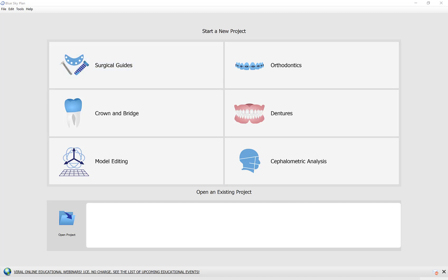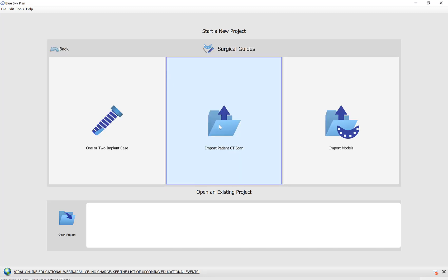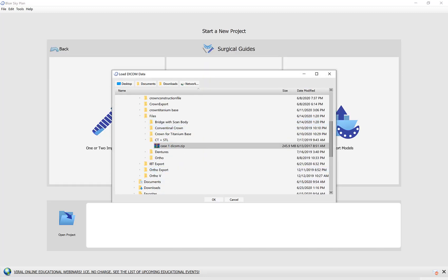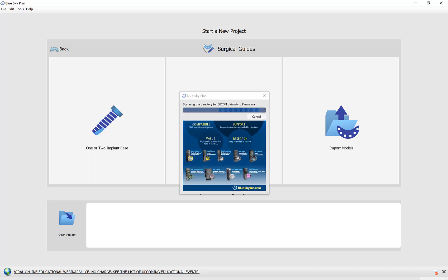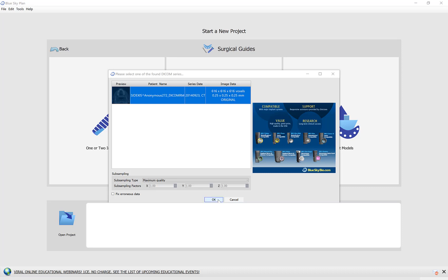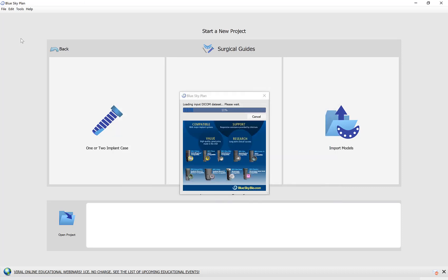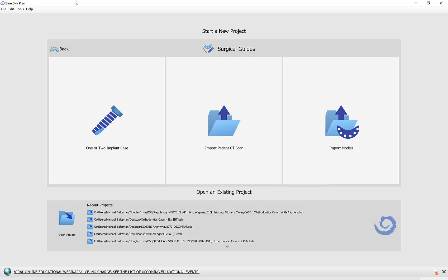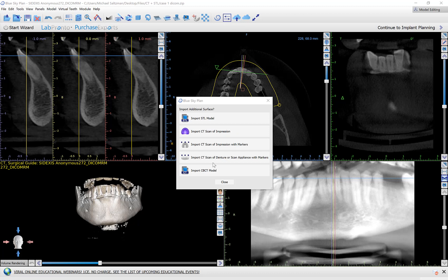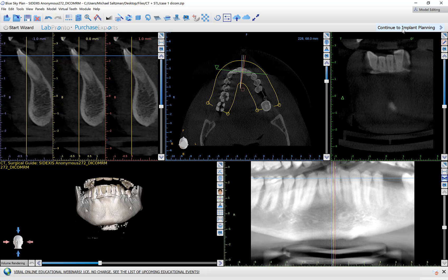So if I go ahead and load a new data set into our surgical guides module — okay, so now we have a DICOM set imported. I'm going to close this and click continue to implant planning.